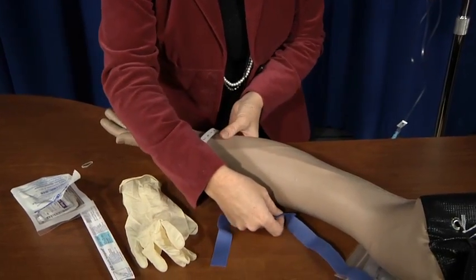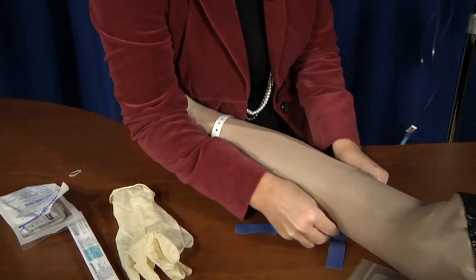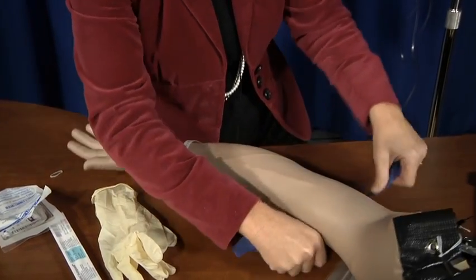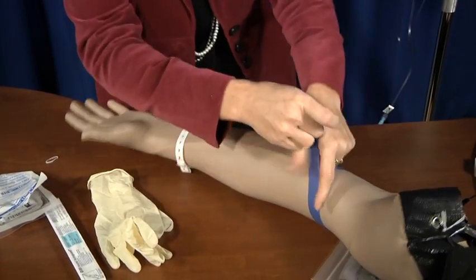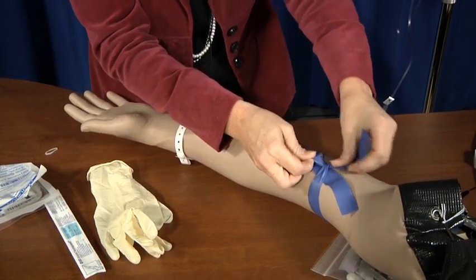When placing a tourniquet, it needs to go up high on the arm to start with because we want to see all of the veins. Later on, we'll put it 2 to 4 inches above our actual site.